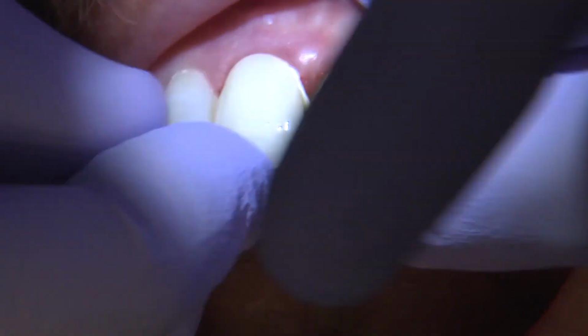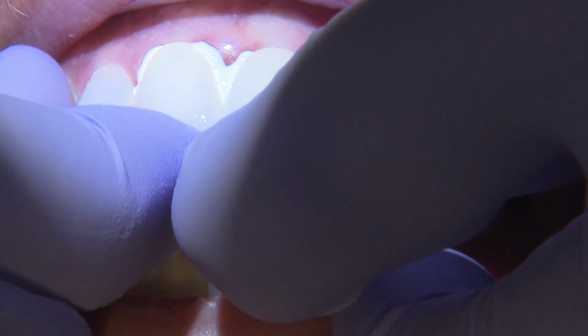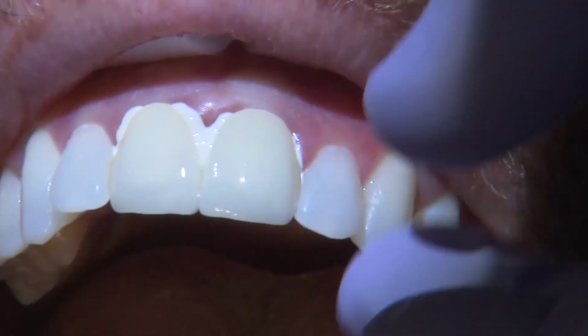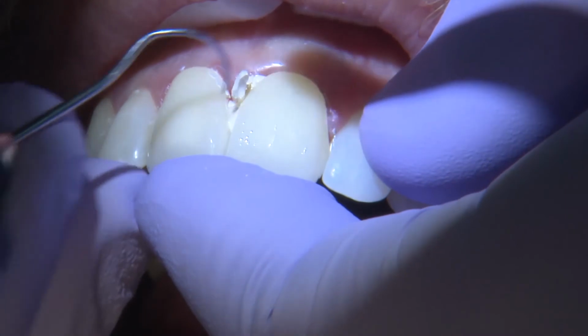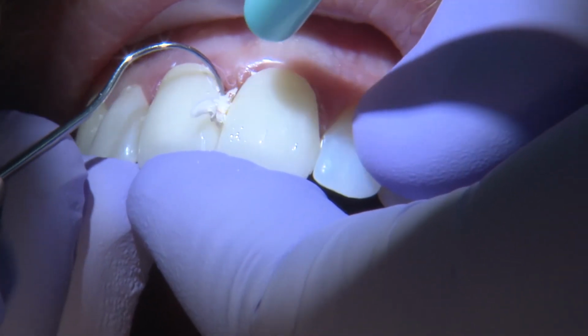Once the temporary cement is completely cured, what I like to do is make sure to remove all the temporary cement. Obviously, leaving some temporary cement behind can cause some tissue inflammation, and in an aesthetic case like this, that is really something that you want to move away from. In any case, it would not be a good thing to leave the temporary cement, but especially in a case where I'm treating the patient in the aesthetic zone.